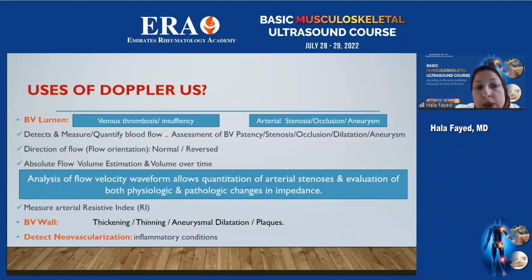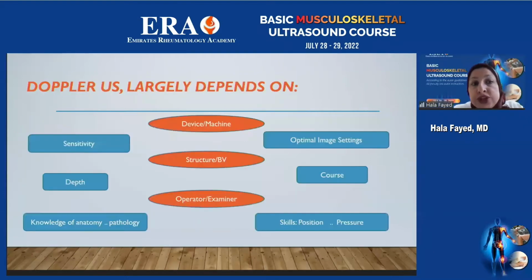This is all about the lumen, but what about the others? It can assess the blood vessel wall, and can show thickening or thinning, aneurysmal dilatation, or precipitated plaques on the inner side of the wall. And more, it can detect neovascularization, the thing we use it most for in inflammatory conditions and detecting disease activity in our rheumatologic diseases.